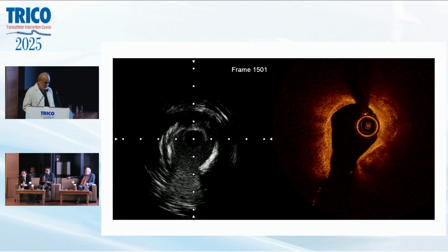Yeah, I think this is simply fantastic. We all know that if you have calcium opposite the carina, and if you have a nodule right at the carina, both are a problem, because the calcium opposite the carina is going to shift the stent onto the side branch and occlude it, or at least make it very, very ugly looking. And calcium at the carina is going to make it very difficult for the stent to expand normally and create a decent bifurcation model that is healthy for the patient in the long run. So both need some thinking, and along with the tools, what kind of modification you need to do. And I think the Atlas is going to be great, but this is a discussion which could go on. Any comment?